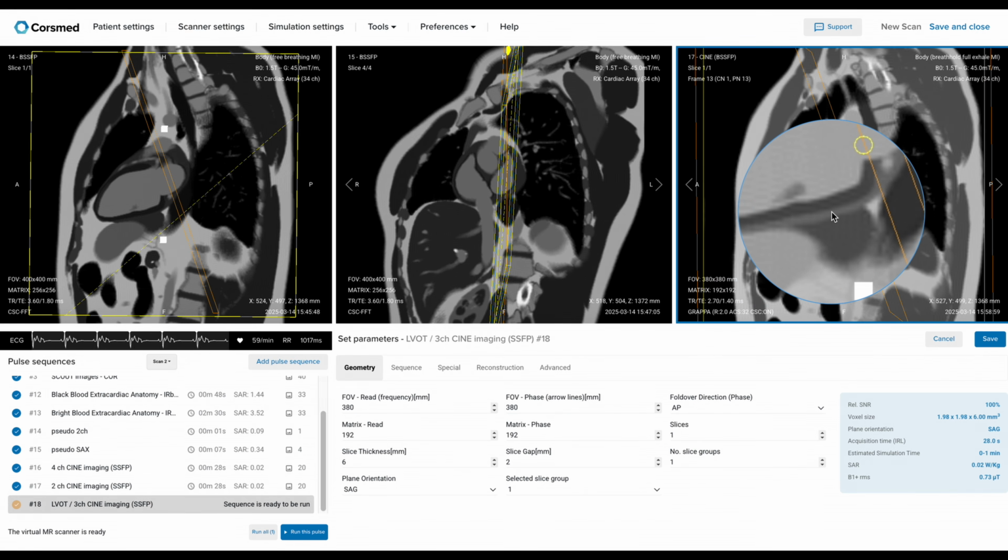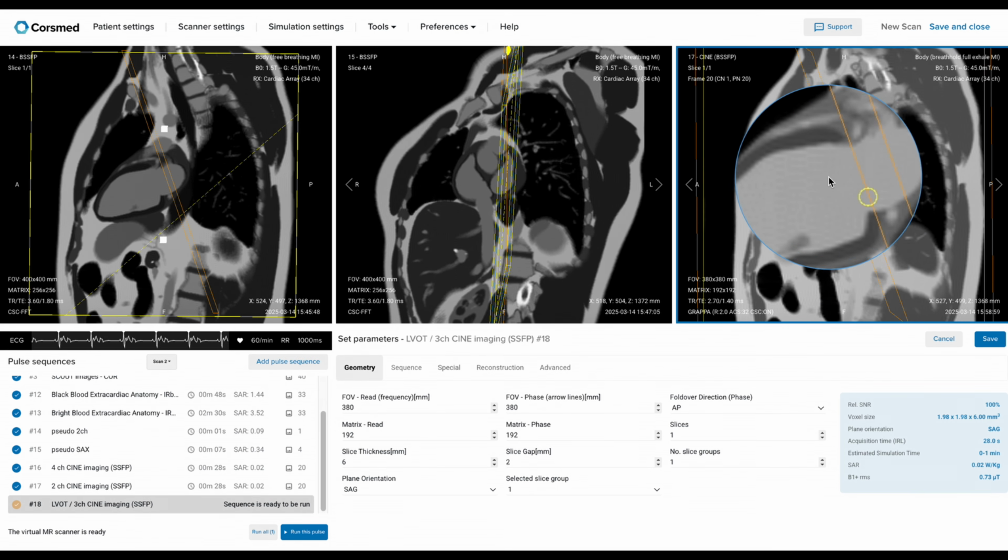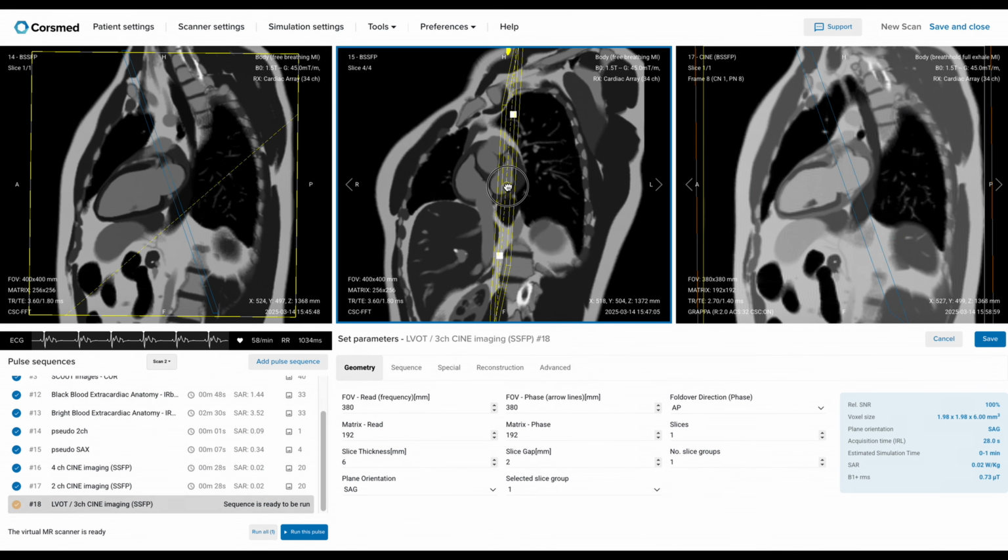Sometimes the right ventricle is so large, it appears beneath the left. You should try to avoid including it. But in some cases, pathology makes that impossible. For example, if I shift the slices slightly, like this, I'll end up including part of the pulmonary artery and the right ventricle in the image. So that kind of image is not accurate for a true two-chamber acquisition. This one, however, is a great two-chamber view. We can see both chambers, the left atrial appendage, and almost no pulmonary artery getting in the way.